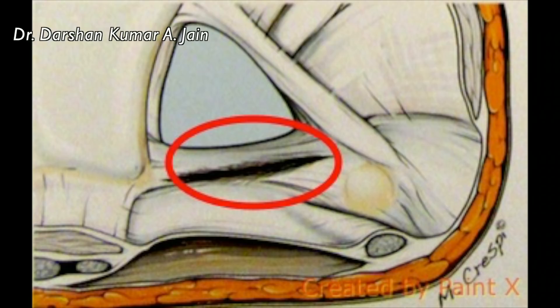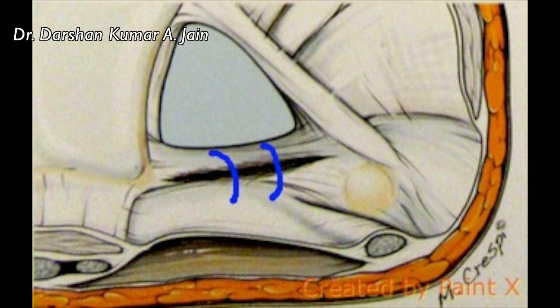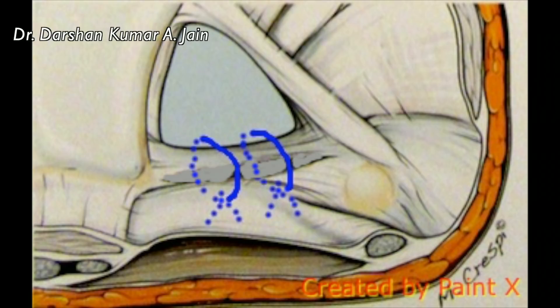I'll be demonstrating the capsular repair at the dorsum, which is repaired using the needle and PDS by two simple sutures as shown here. There are various suturing techniques; these are the simplest ones.